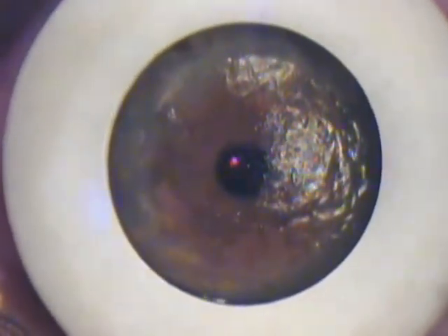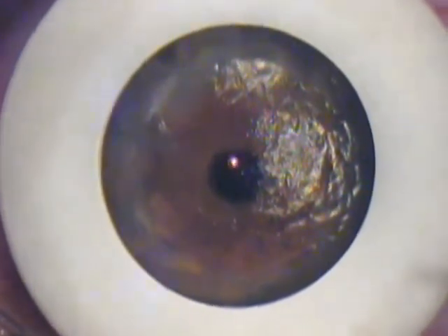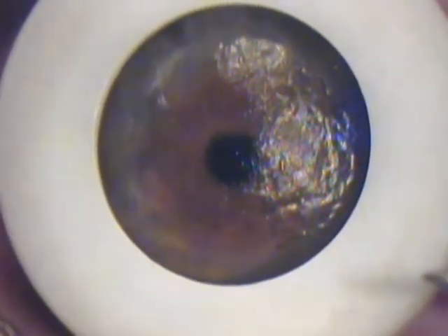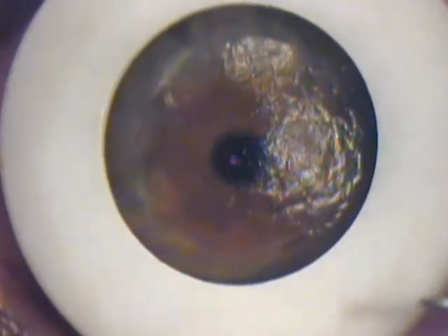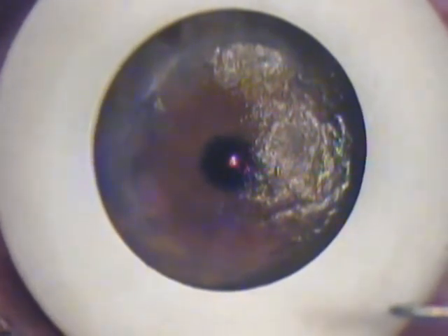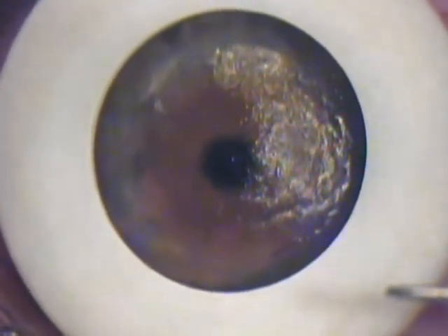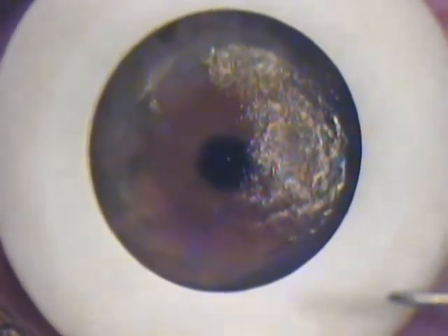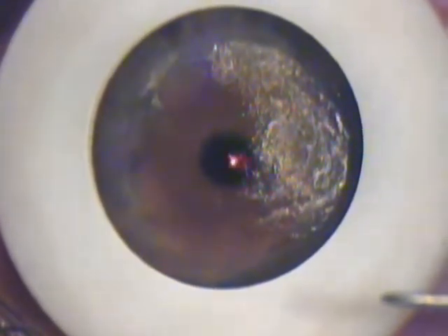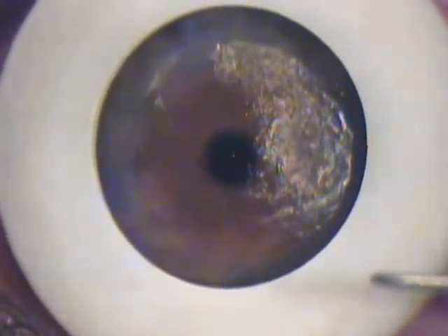Then we place an 8.5 millimeter mask to protect the edges of the host tissue and perform an excimer laser photoablation to finish smoothing the interface and get an even finer remaining tissue, which will give us a resulting better final visual acuity. The program we use is PTK at 9 millimeters.